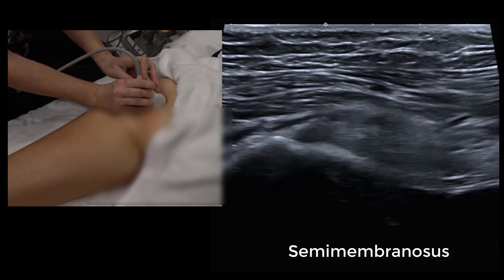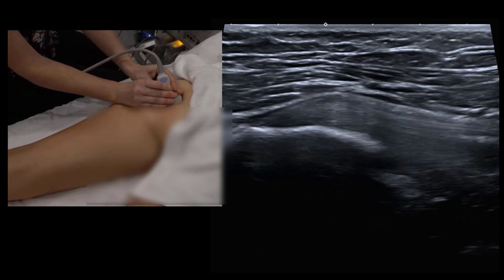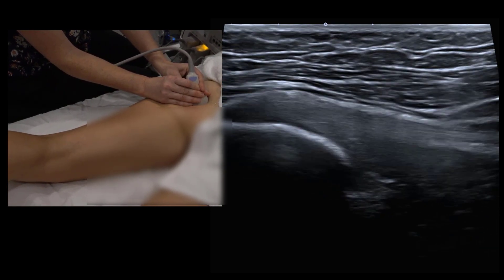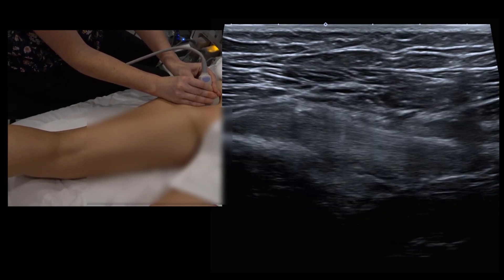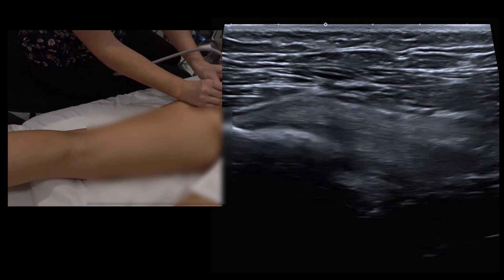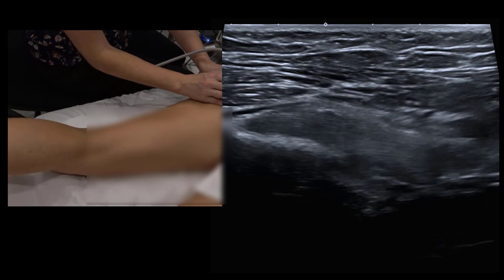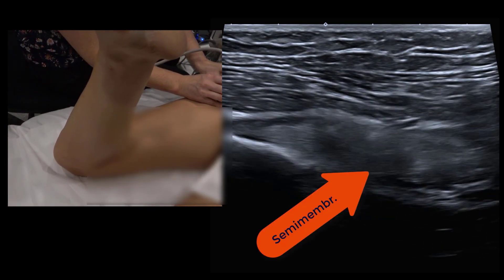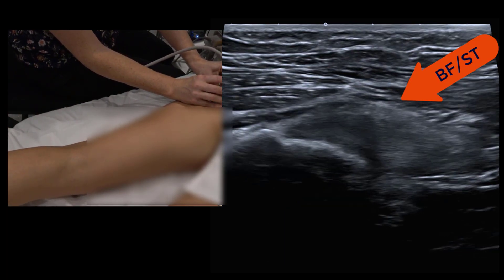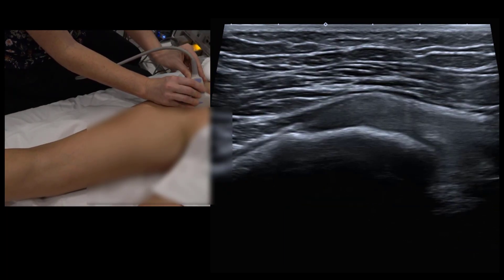To see these structures more clearly, ask the patient to lift the lower leg off the table — slight knee flexion to activate the muscles — then relax back down. You can see the semimembranosis sag back with each repetition, and the conjoint tendon is clearly visible.